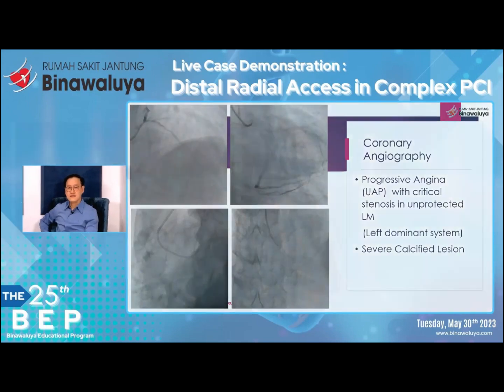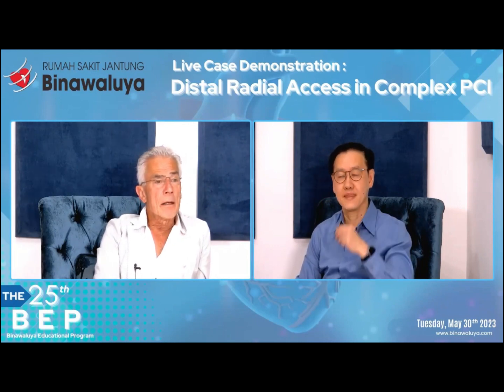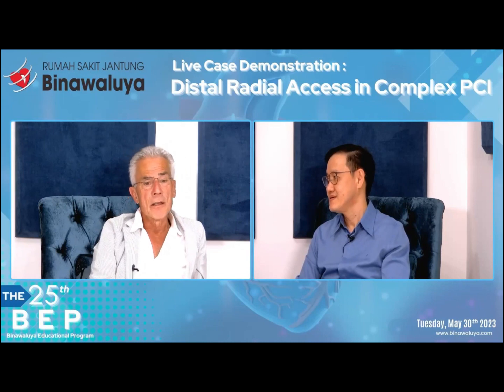I think it's a beautiful demonstration, and it shows the value of distal radial, because I think this procedure took more than an hour. Maybe a few hours. 3 hours. So yeah, this is actually the power of distal radial, because the patient is very comfortable. 3 hours with the arm rotated in a nasty position is very stressful, and also for the operator who needs to work over the patient.